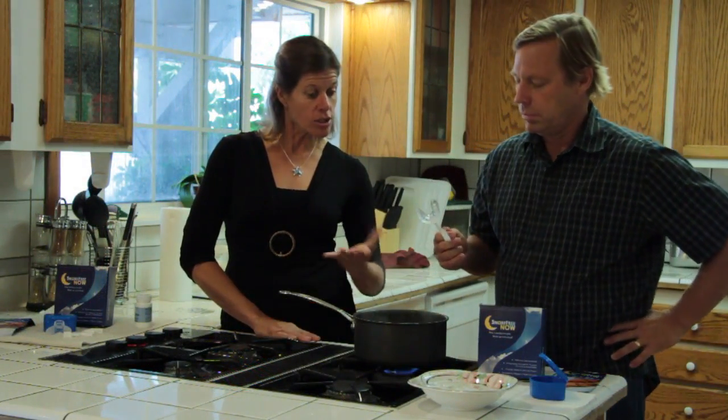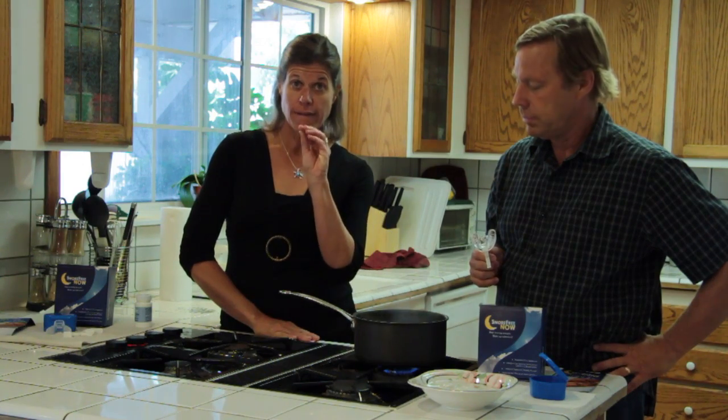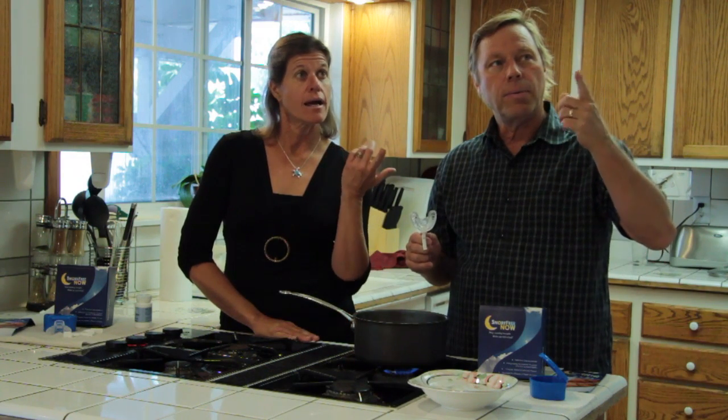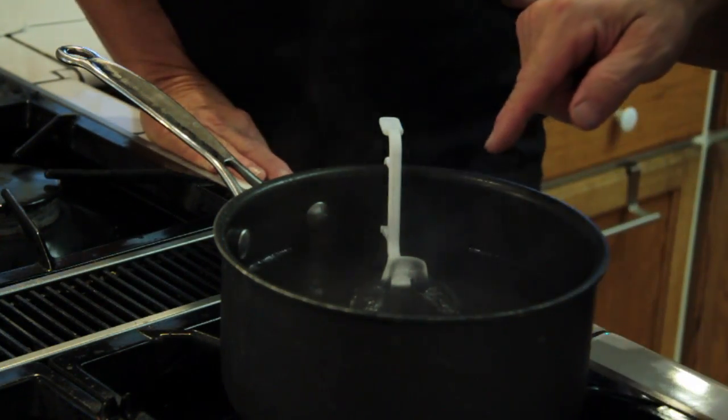All right, so it looks like our water is now boiling. Yep, it's boiling. Perfect. So now, follow along carefully. It is time to put your mouthpiece device into the water. Look at the clock, and I'm going to wait until it gets to the one there. Perfect. Let's go in. Ready? Here we go. Remember, only 50 seconds.